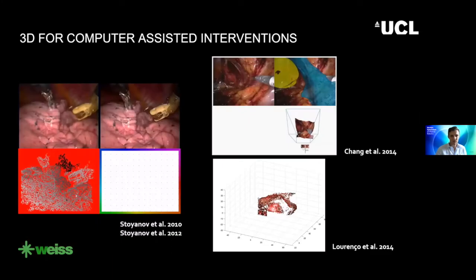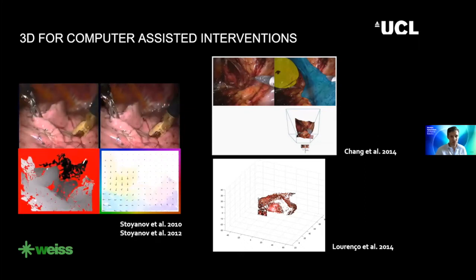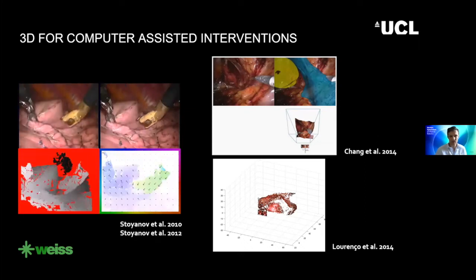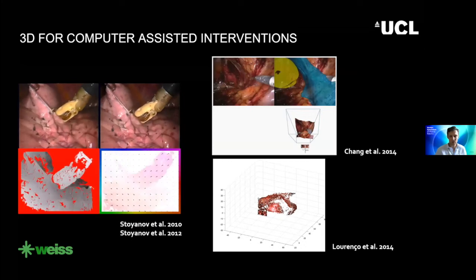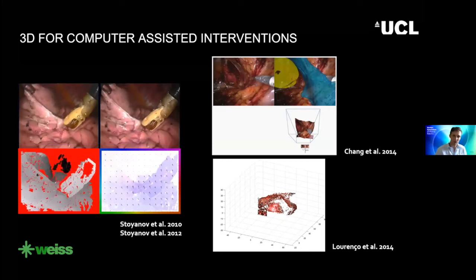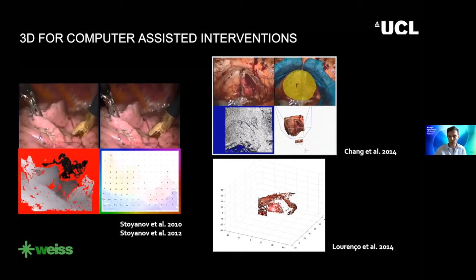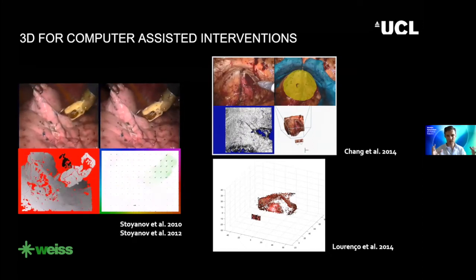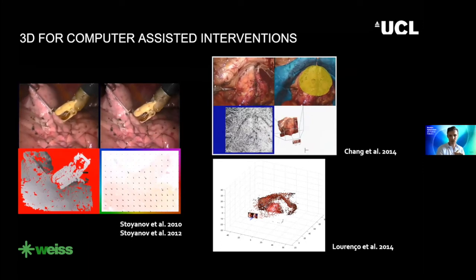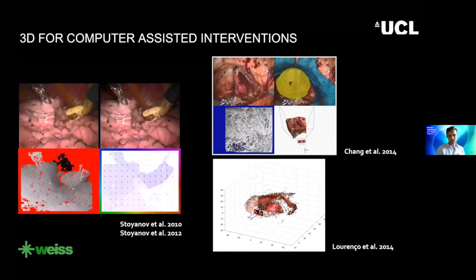And we've been working in this area for a number of years, not just ourselves, but the community, of course. And here you see some examples over the last 10 years of how you can take stereoscopic images from da Vinci or other systems that use stereoscopes and generate 3D depth information, 3D flow field information, so motion fields. You can use this information to calculate the motion of the camera, which is obviously important if you want to maintain the alignment of navigation systems, and potentially map out very large scenes, understanding the full shape of the surgical site. So all of the examples that I'm showing on this slide here are using model-based vision.